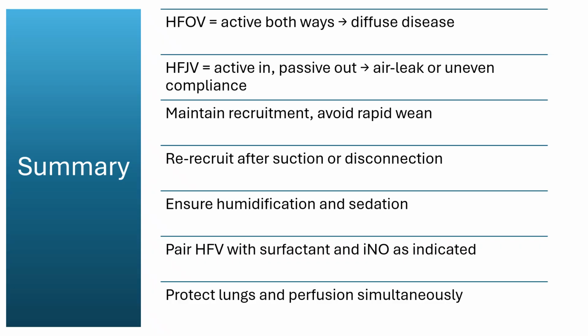Lung volume should be established gradually and preserved through consistent mean airway pressure and prompt re-recruitment after suctioning or disconnection. Rapid weaning or abrupt pressure changes risk collapse and oxygen instability. Adequate humidification and sedation prevent resistance and promote synchrony with the ventilator.